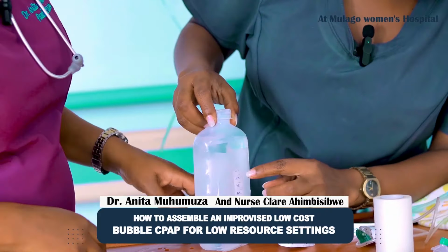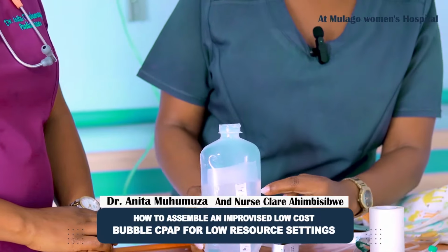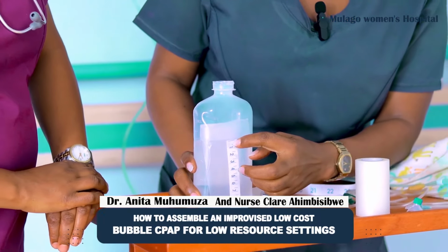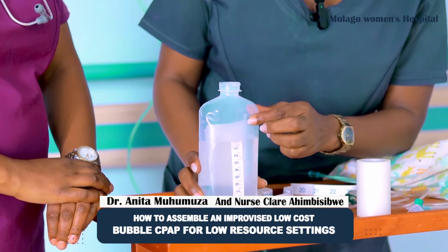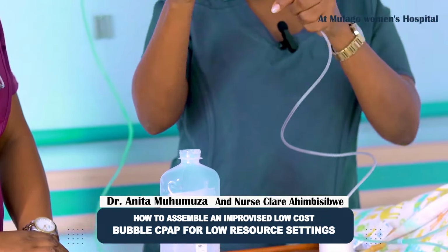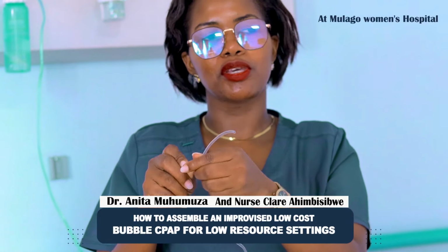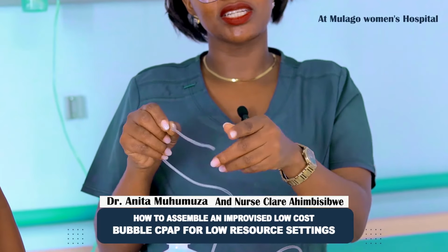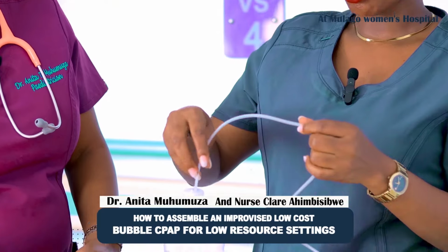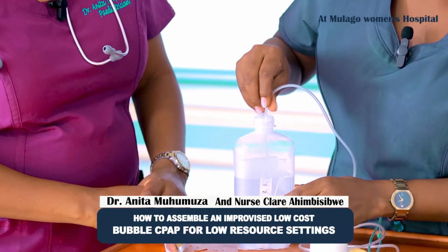And then we shall pour water up to the zero mark. So we now have our distilled water at the zero mark in our bottle. We've already connected the tube, and the extreme end of the tube we are going to dip in the water up to the PEEP that we need. For this case, we need a PEEP of 5. Put it in this bottle that has distilled water up to the 5 centimeters mark.